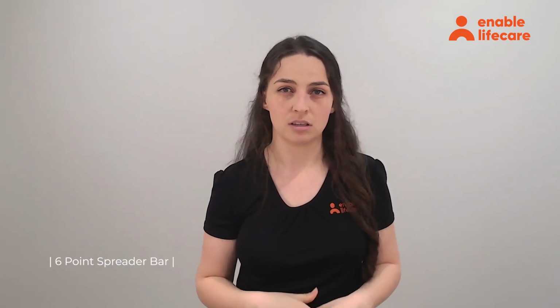However, you can get your 4 point yokes or spreader bars that are kind of this rounded attachment. So it's going to be a lot more open in front of the person's face. So they're going to probably feel a bit more comfortable. There's going to be less of a risk of that spreader bar or yoke hitting their head, and it will probably decrease a bit of anxiety as well.